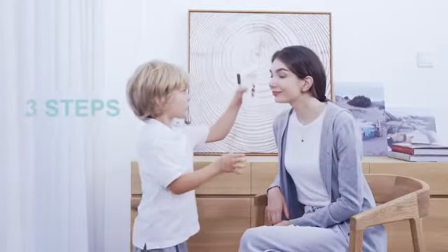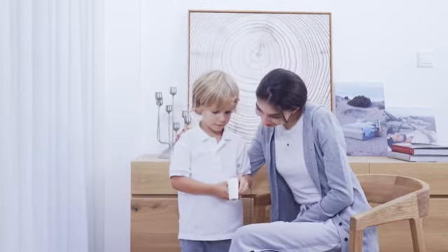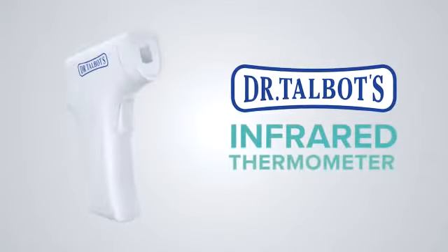Just hold, aim and press — so simple that even your child can take your temperature. For trusted results, Dr. Talbott's non-contact infrared thermometer.